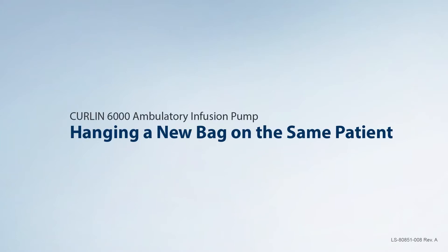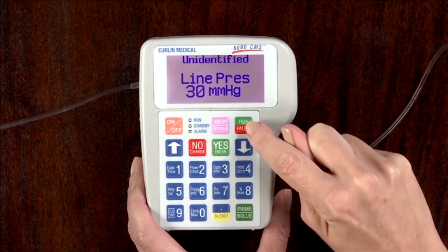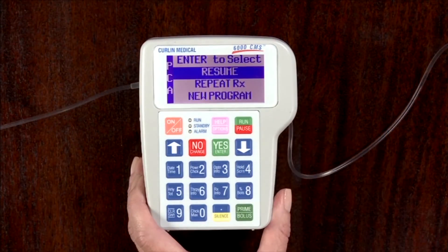Hanging a new bag on the same patient. To hang a new bag, press the run pause key to pause the pump. Connect a new IV bag to the new administration set as necessary.